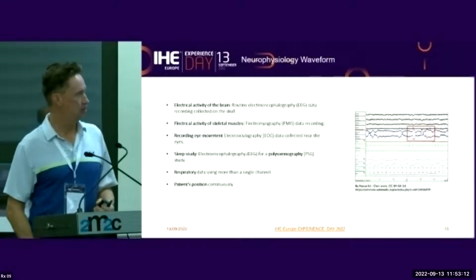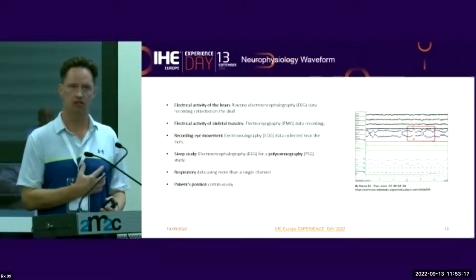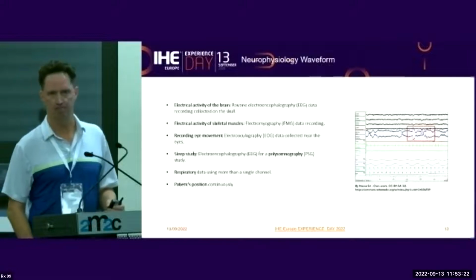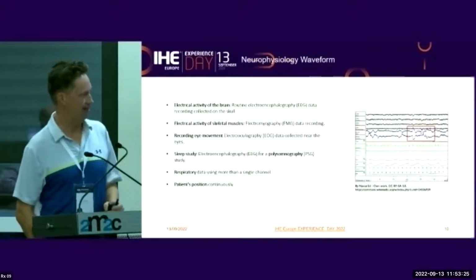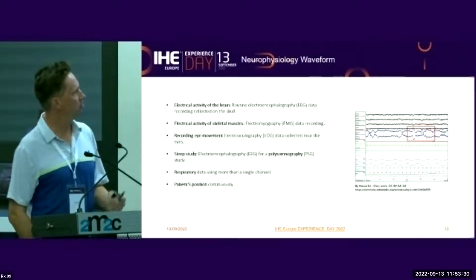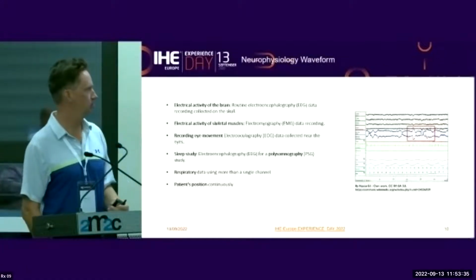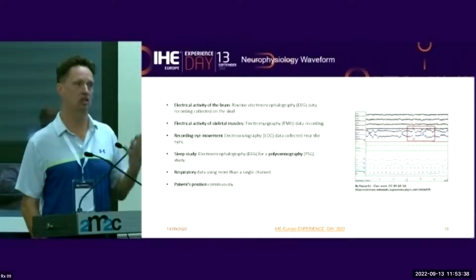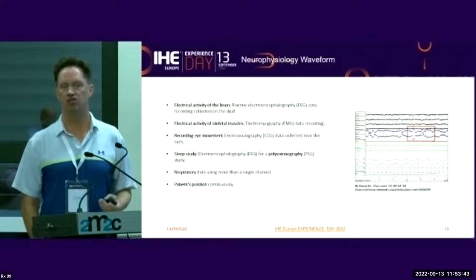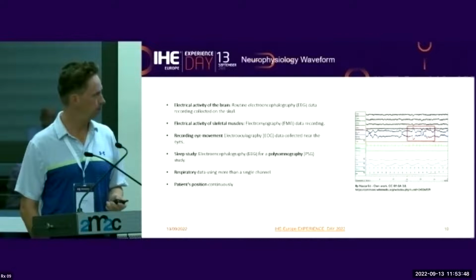Another one is waveforms. We have all the waveforms necessary to do heart studies, like ECG and so on, but now it's also been standardized to do it for the brain. So we have all these different kinds of information standardized for doing sleep research and so on. So activity in the brain, the skeletal muscles around the brain, eye movements, waveforms for sleep studies, the breathing and the patient position and so on. So all these things are now available in the standard to be recorded.